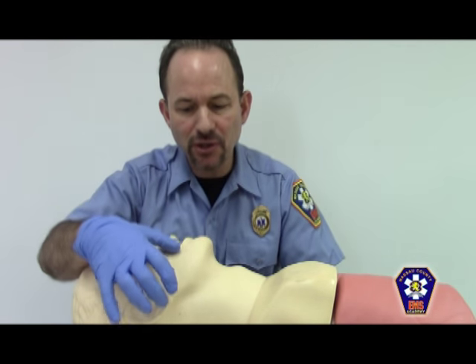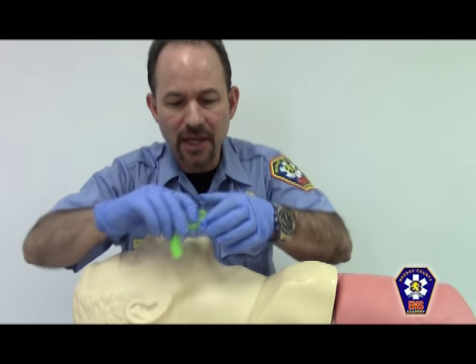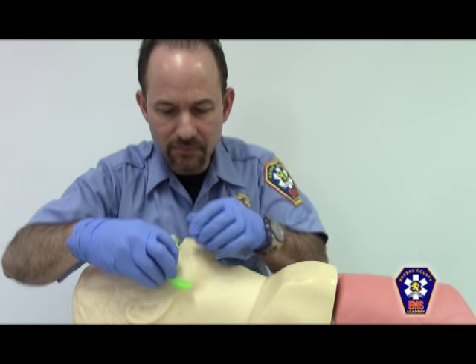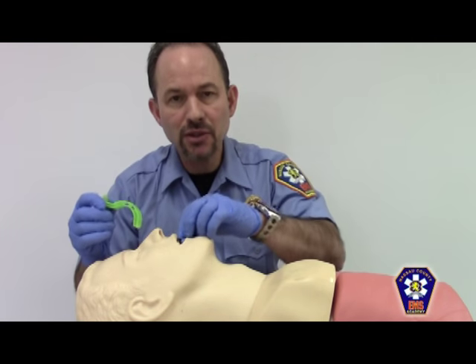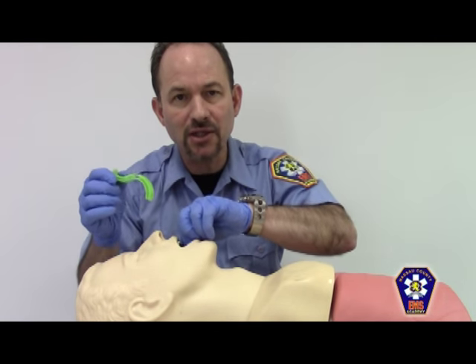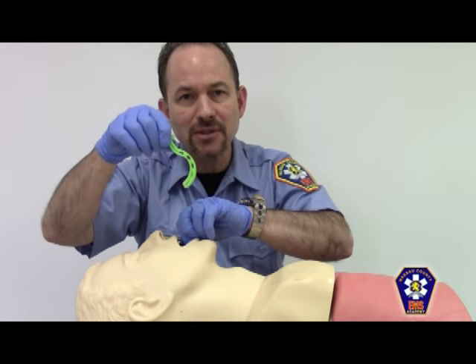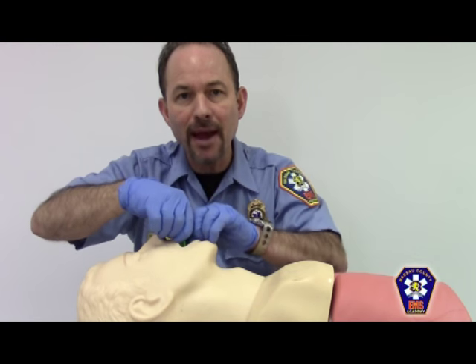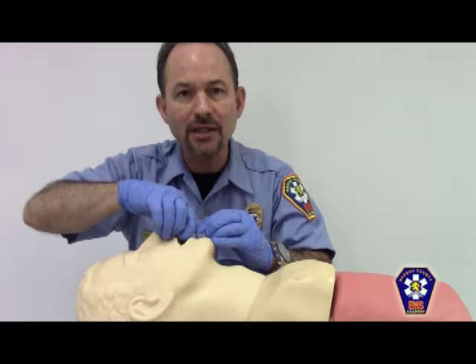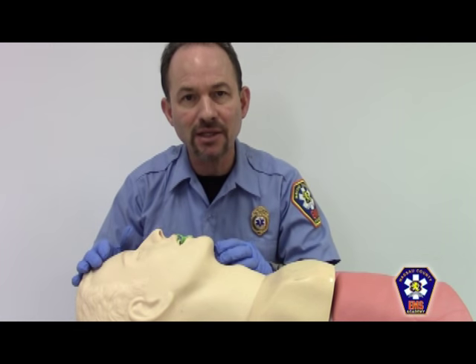Prior to the insertion of an oral pharyngeal airway, we must first measure between the corner of the mouth and the angle of the jaw, like so. Once it's appropriately measured and sized, you can use a cross-finger scissor technique to open up the mouth, holding the OPA 180 degrees in the opposite natural anatomical direction, applying it all the way back to the throat, being certain not to push the posterior region of the tongue back, followed by a 180 degree twist.